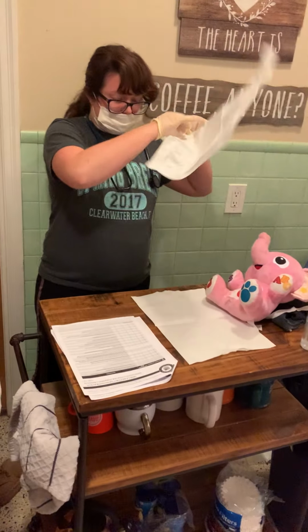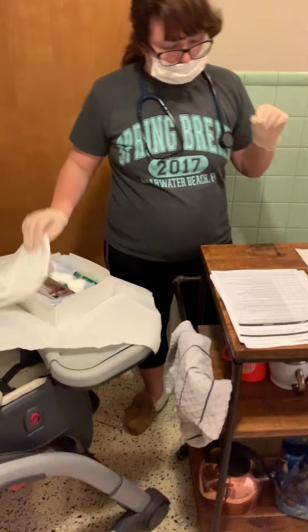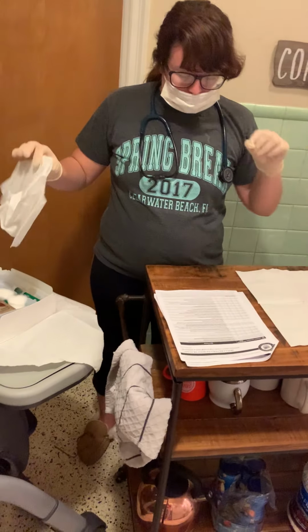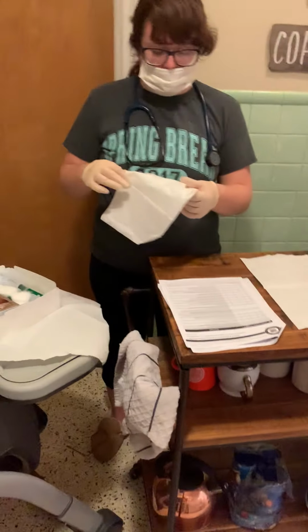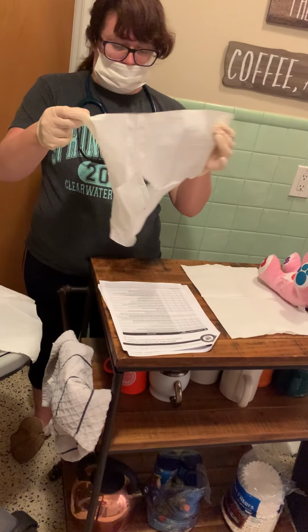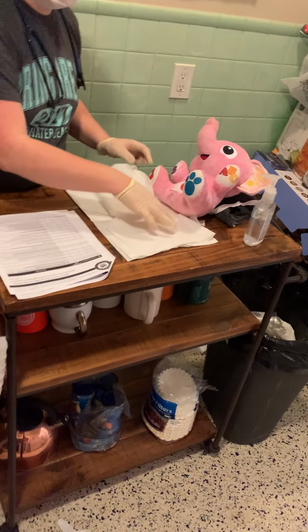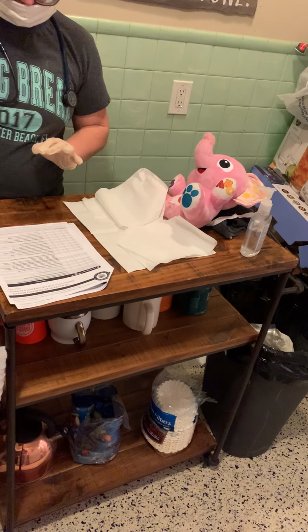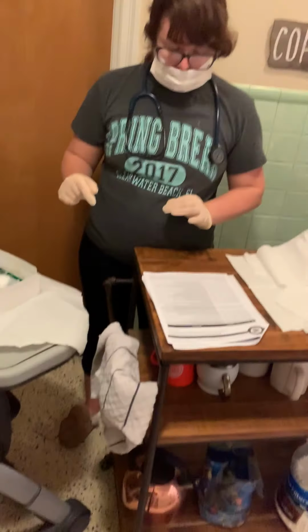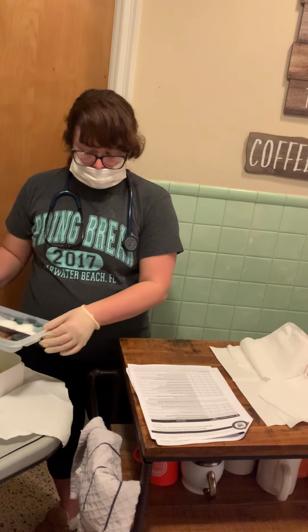Discard of this. Okay. Alright, and again I've established that my right hand is going to be the sterile hand throughout the procedure. Alright. So this is going to go between my patient's legs.